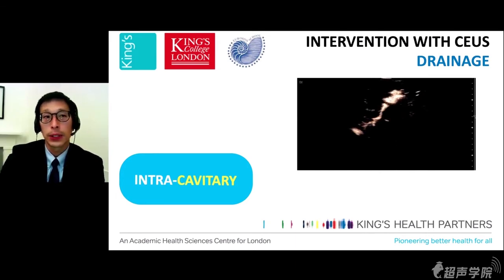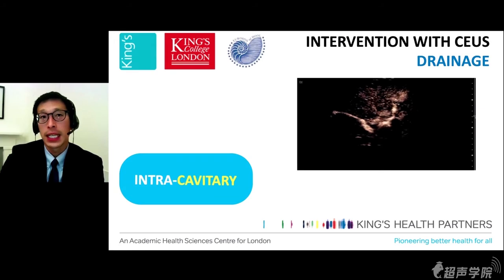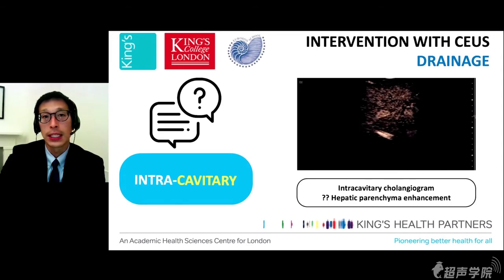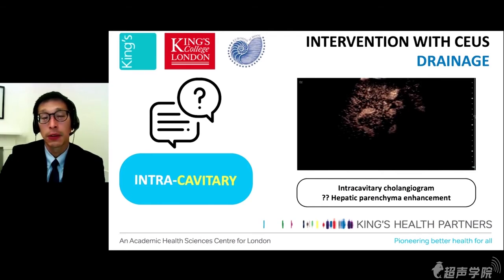This is an intracavitary ultrasound with contrast injected through a biliary drain. And I think for those who have sharper eyes for contrast ultrasound, you may start questioning my statement that this is an intracavitary contrast ultrasound, because from what you can see here, not only can you see the drain, but you can clearly see the enhancement of the surrounding hepatic parenchyma, which implies that there is enhancement of the microvasculature of the liver. How can this happen, or what does this mean?